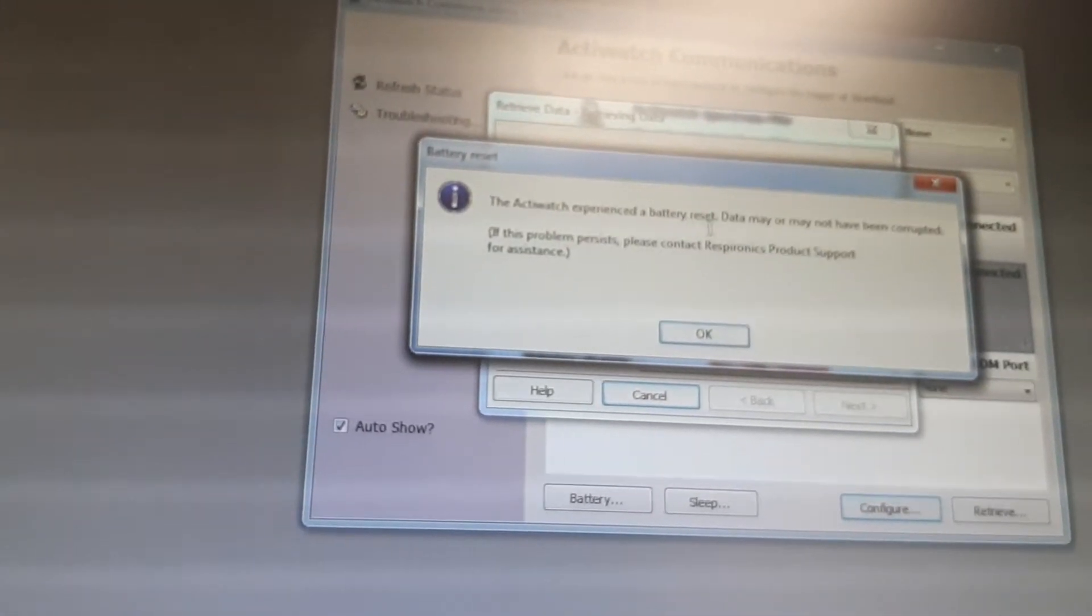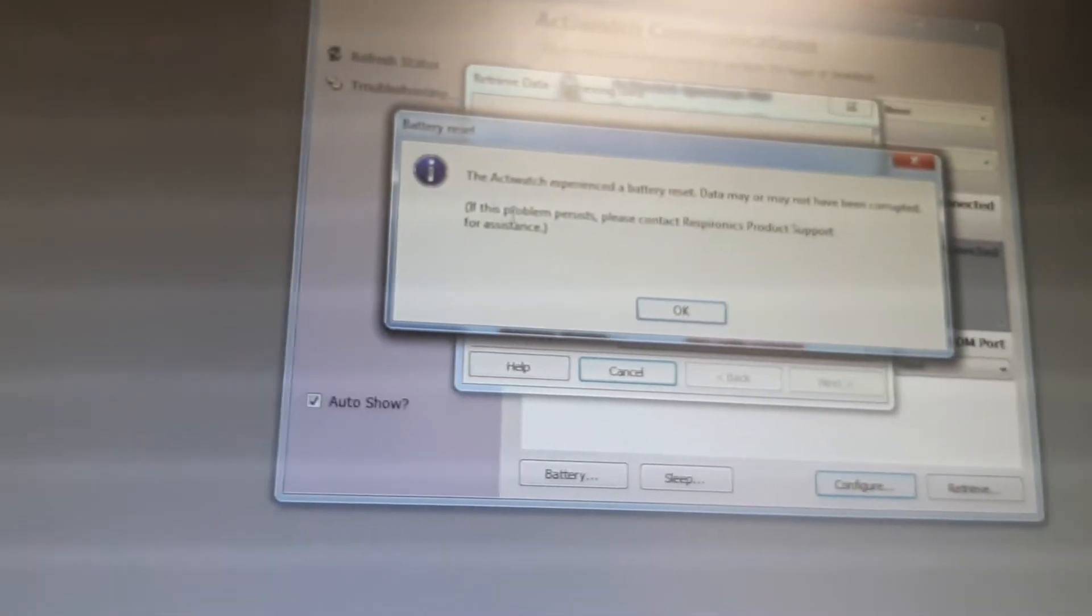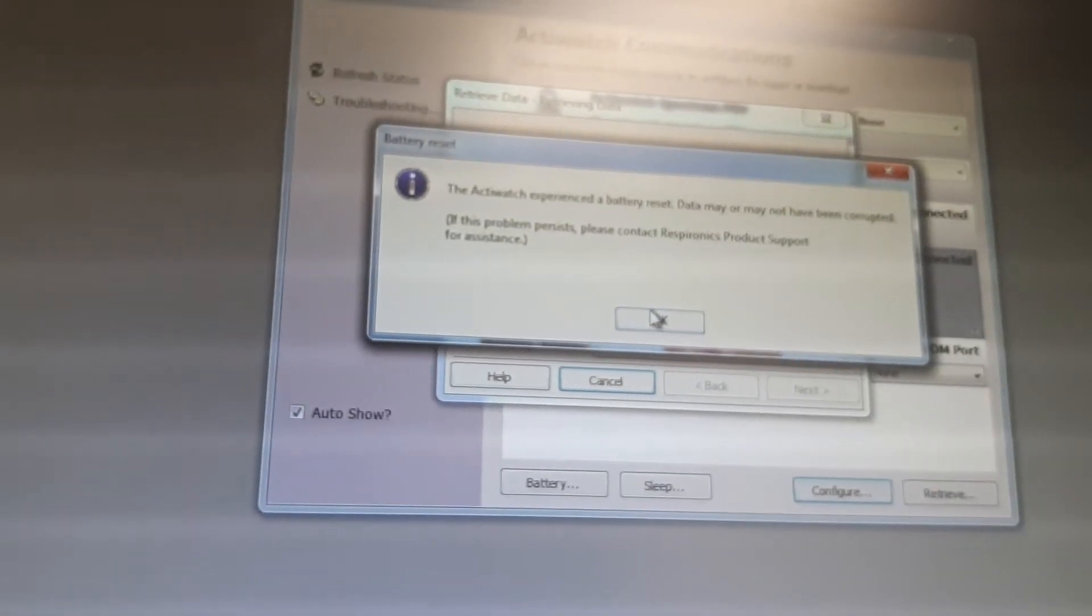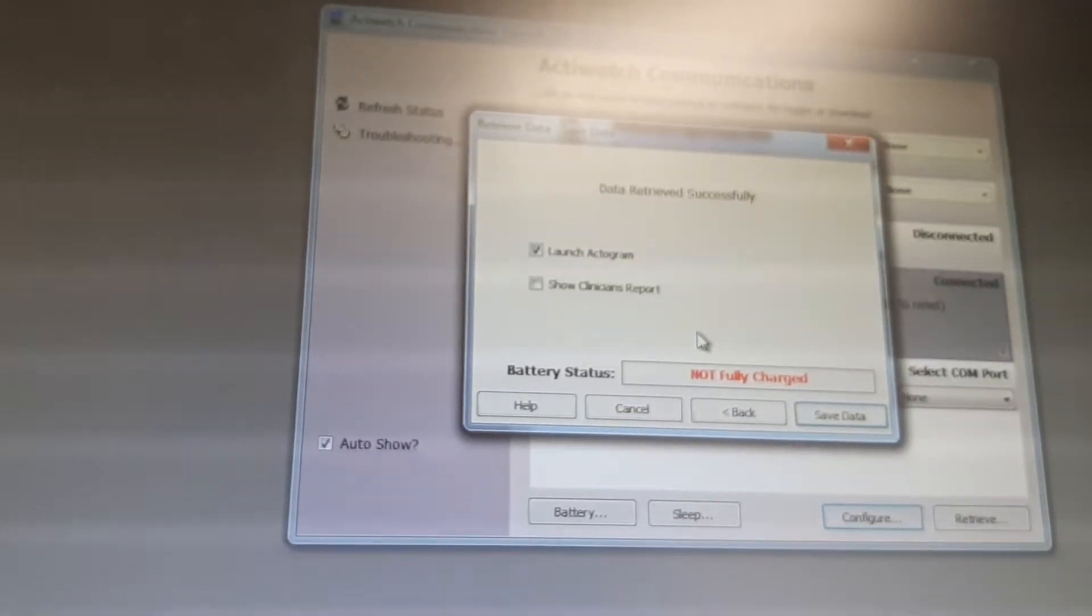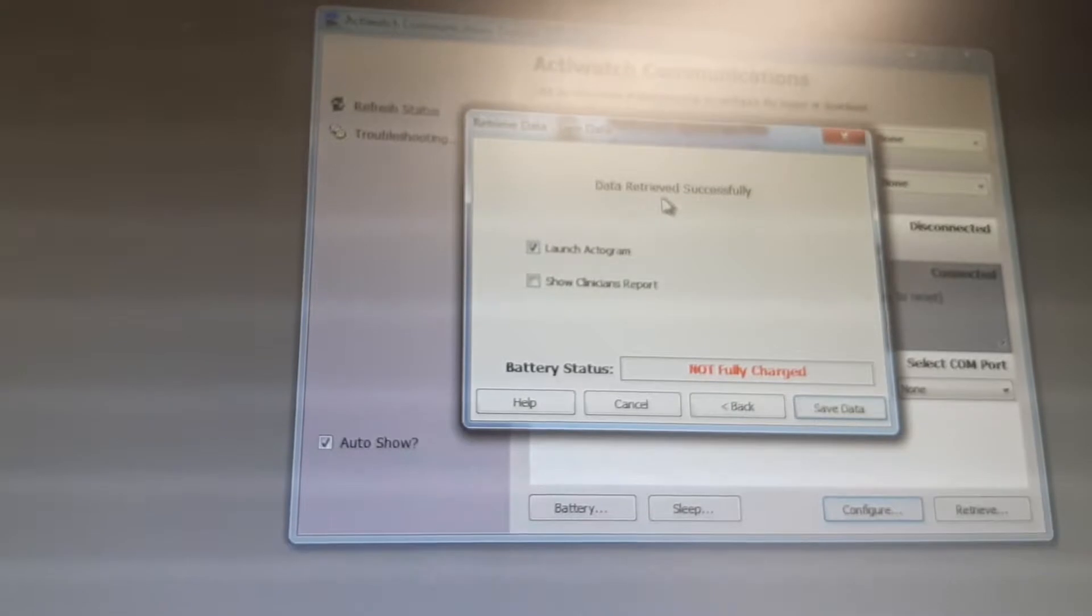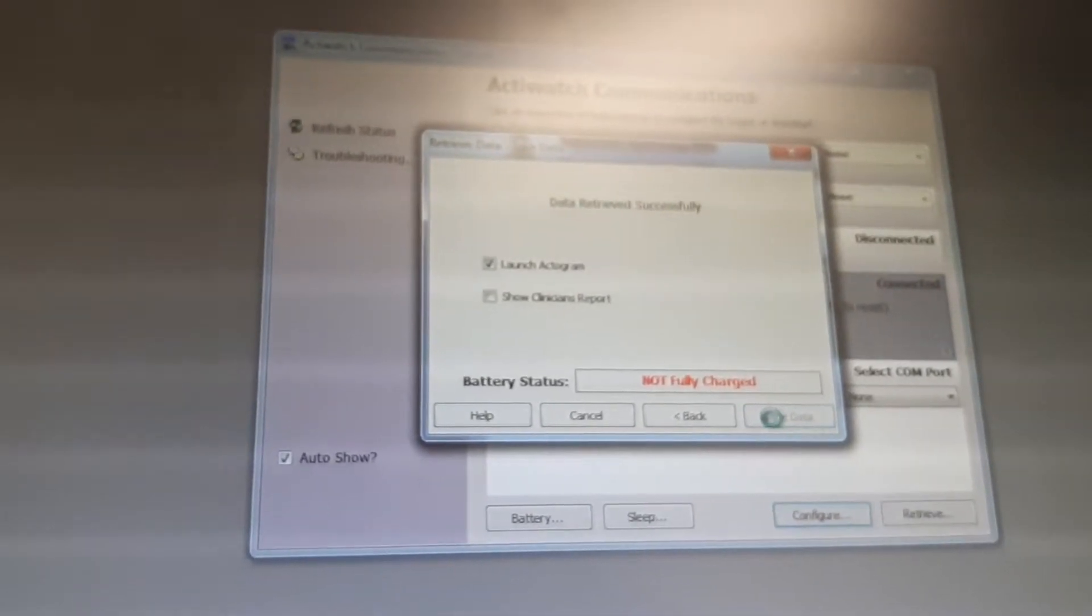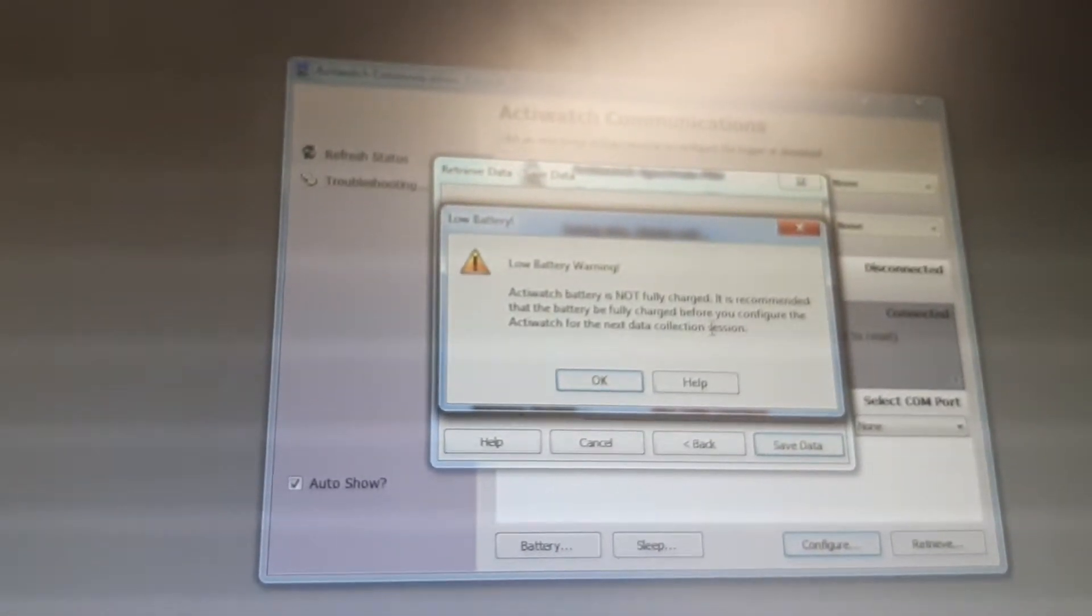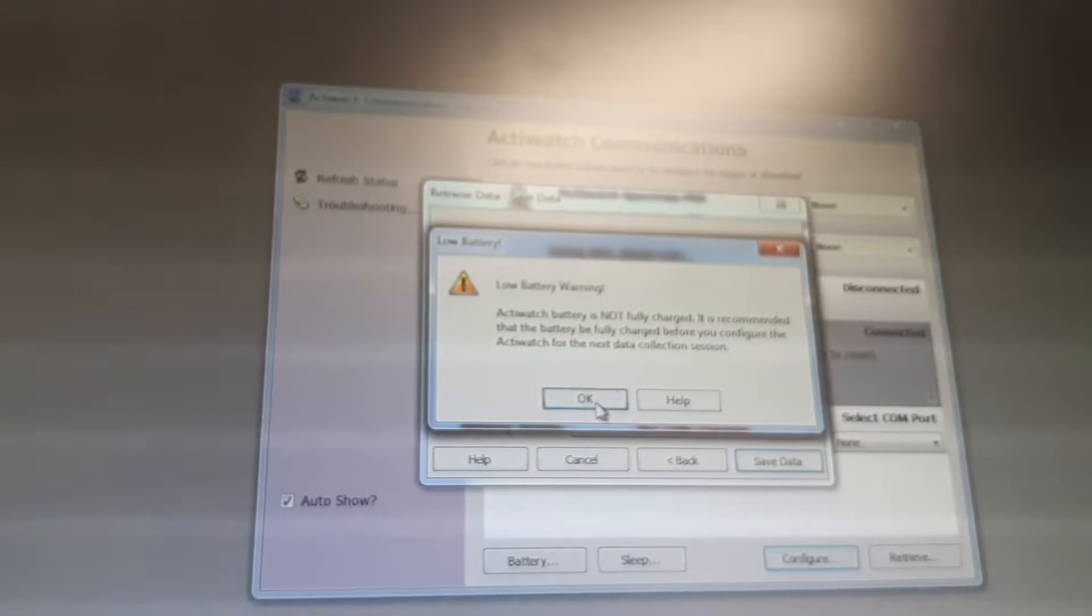The battery reset, data may or may not have been corrupted. It is a problem. If the problem persists, please contact product support. Okay, let's see what is going to happen. Data retrieved successfully. Then save data. Of course, save the data. Actiwatch battery is not fully charged. It is recommended the battery be fully charged before you configure the Actiwatch for the next data collection.